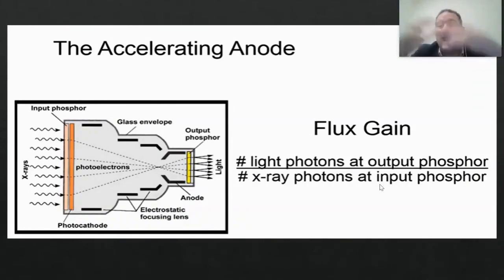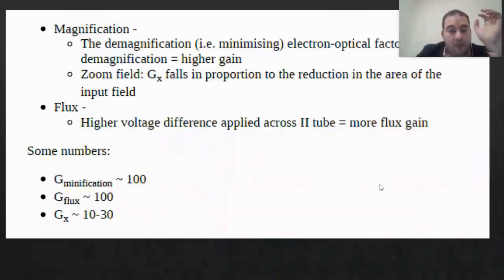However, brightness gain cannot be measured directly. There is no way to measure it. So, how can I measure it? There is something called the conversion factor. The amount of luminescence you received, relative to the entrance dose for the patient, can be determined using an ionization chamber on the patient, and you can know the exact dose that reached the skin. What is the entrance dose? Exactly.